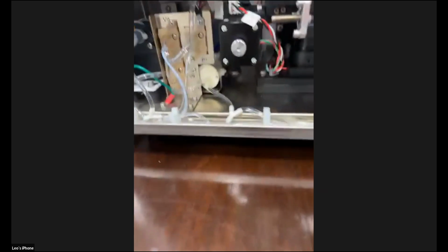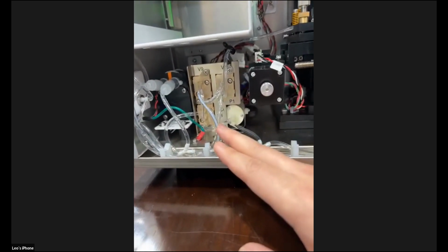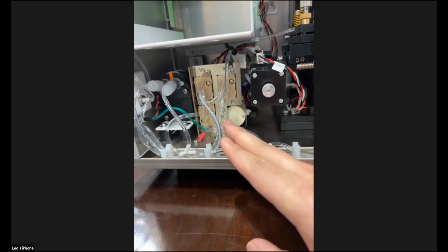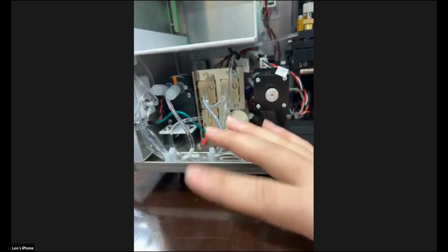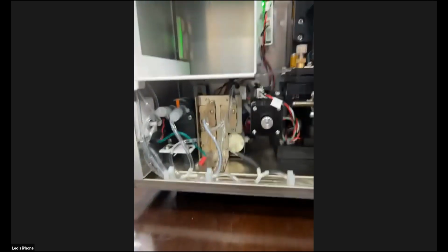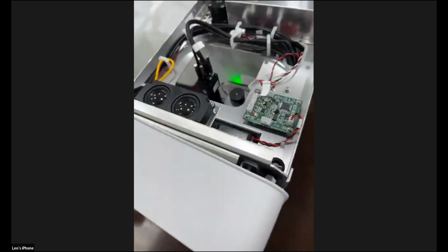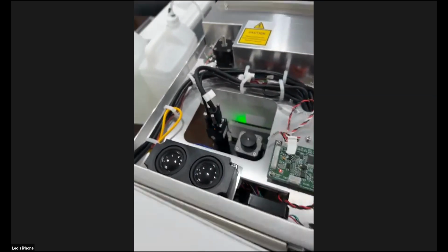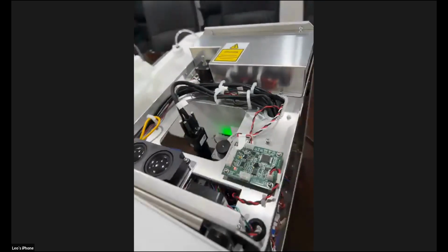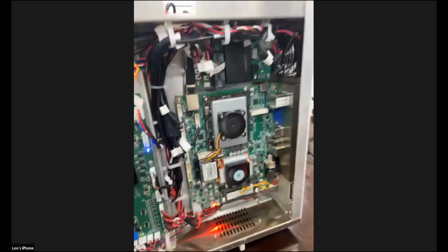And for the left side, we have the valves, the pumps, and the waste pump. All of that controls the fluid circuit, to test, to maintain, to clean. All of this motion can be controlled here. And from the right side, I think this is very important.